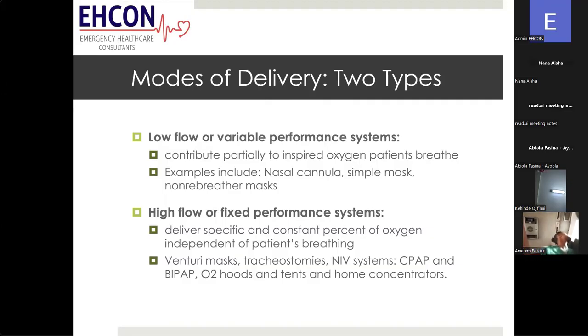So we're going to go through some of the examples in each category, just to talk through the different modes of delivery. I tried to pick the ones that we see the most in hospitals, because I think a lot of us just grab an oxygen delivery device, and maybe we don't really know the background of what we are using and how it works.